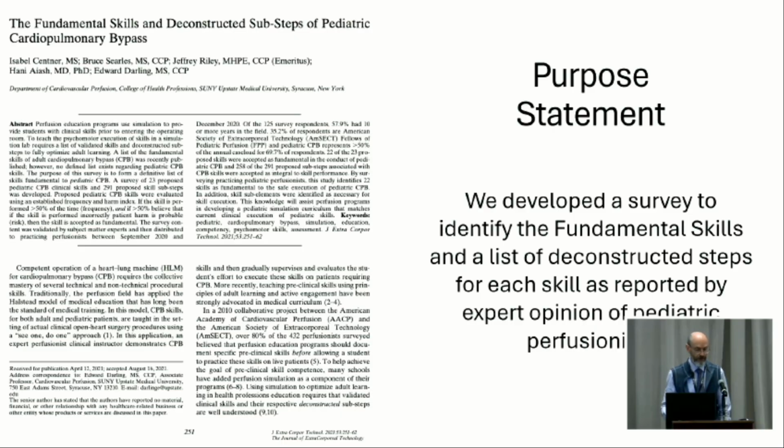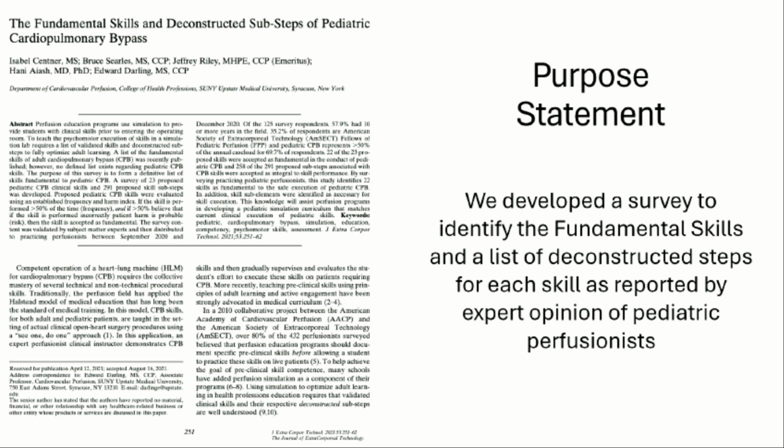We set out to understand from the perfusionists in the community, the pediatric perfusionists in the community, what the fundamental skills are. What do you do when you go to work? And look at the part there for deconstructed subsets. What do you do when you go to work, and how do you do it? What are the little elements? If you initiate bypass, what are the 5, 10, 15, 20 things that you do when you initiate bypass? What is there tremendous consistency about?